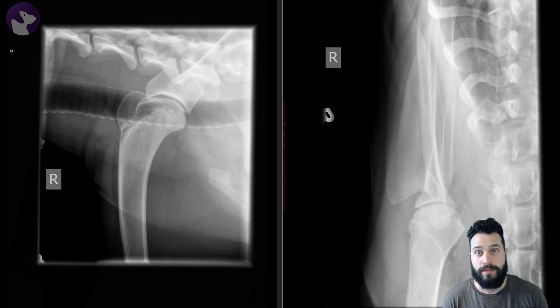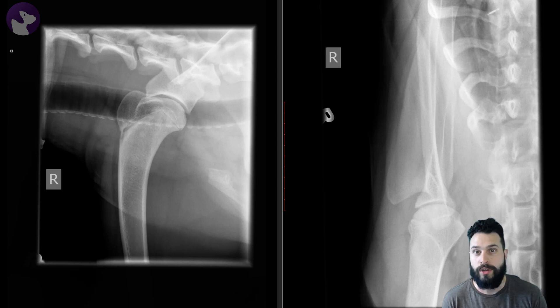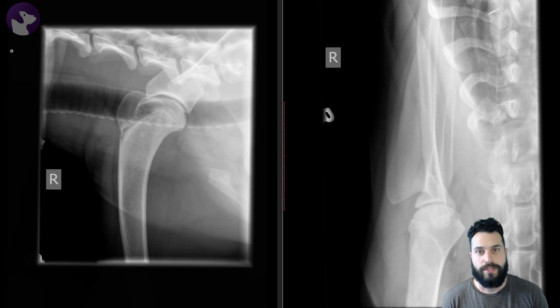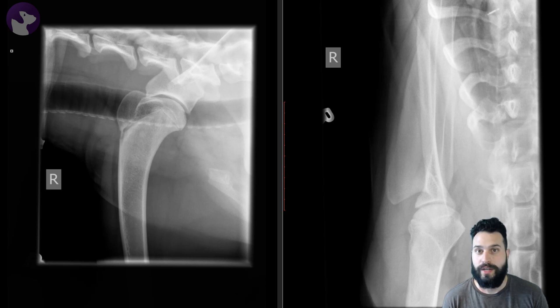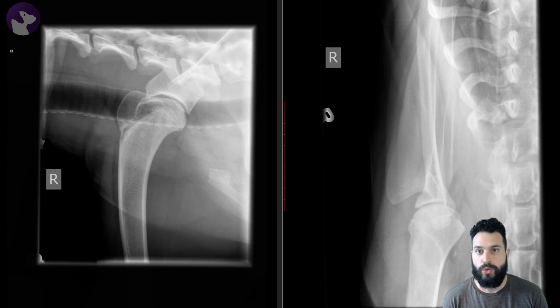One of the really important things is going to be to use our physical exam to figure out where to take radiographs, because the shotgun approach to radiographing everything isn't really going to help us. It's going to make it really challenging to identify subtle lesions, and we're going to need nicely collimated radiographs. In this instance we localized the lameness to the shoulder, so we took radiographs of the right shoulder.